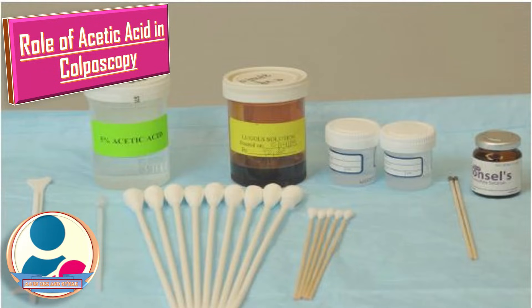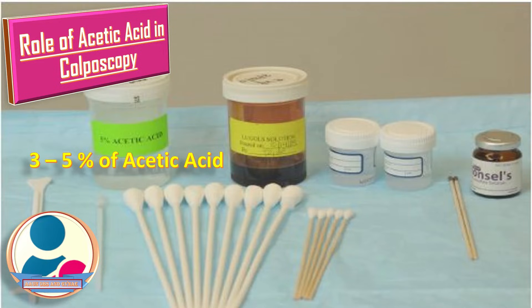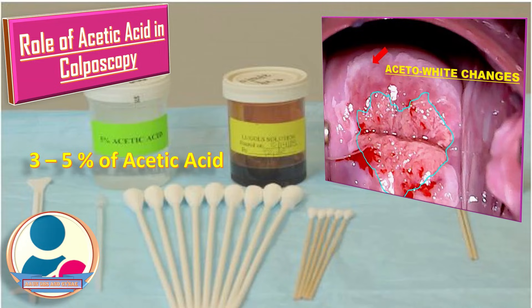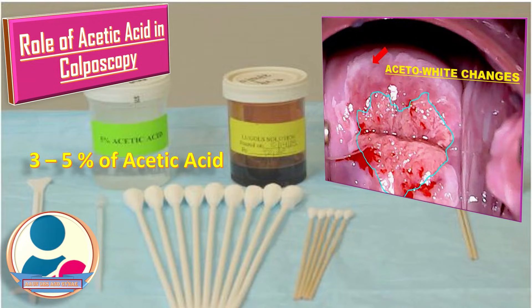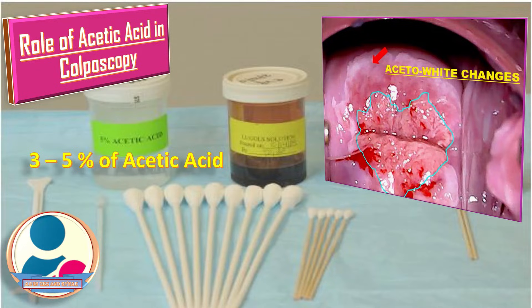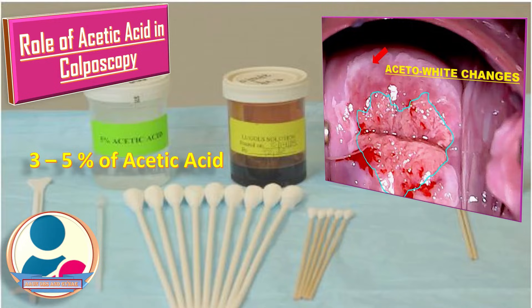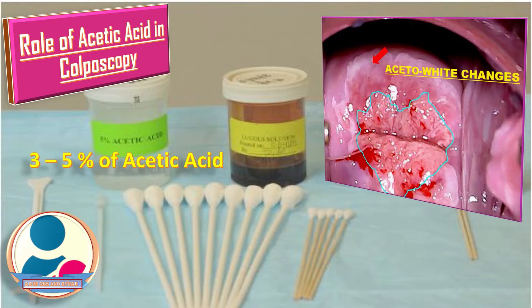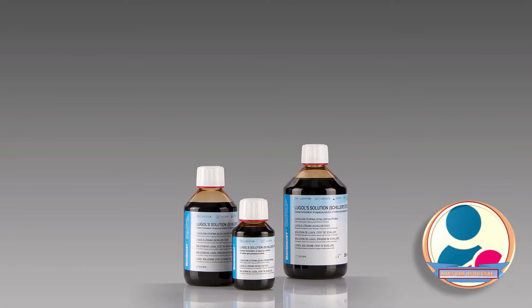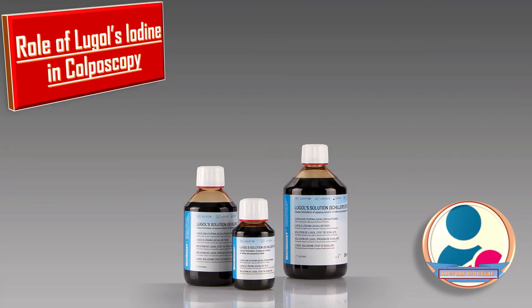Three to five percent acetic acid is taken up by neoplastic cells, resulting in aceto-white changes. Acetic acid application coagulates protein and stains abnormal cells white. Squamous metaplasia appears glossy white on application of acetic acid.